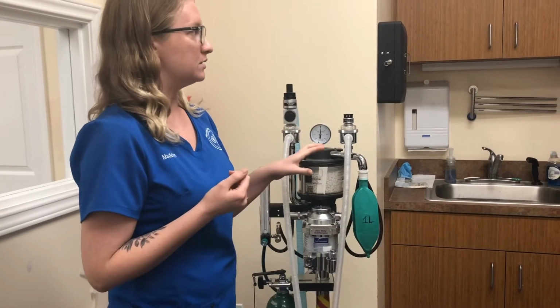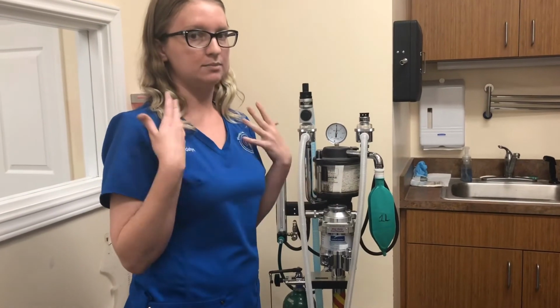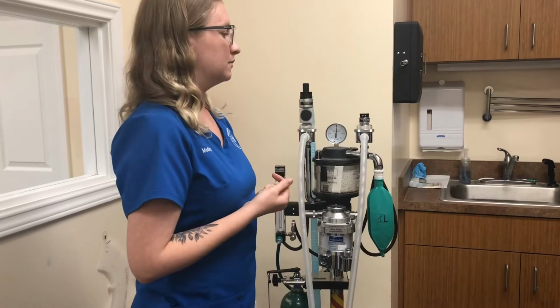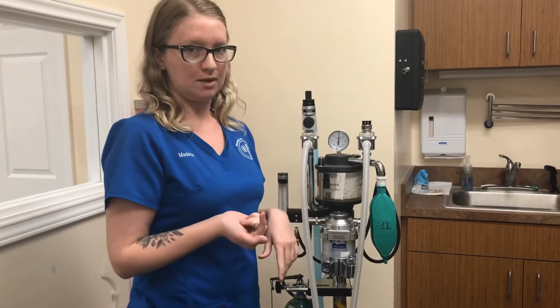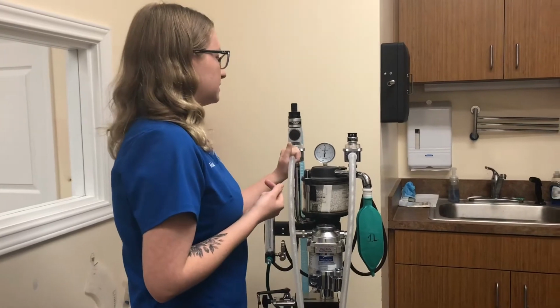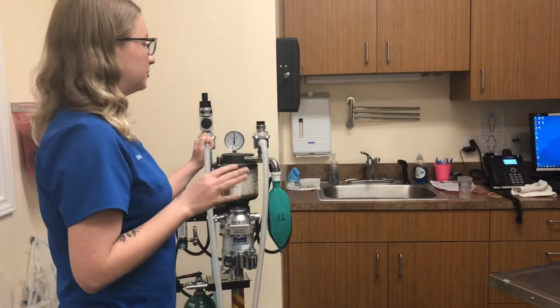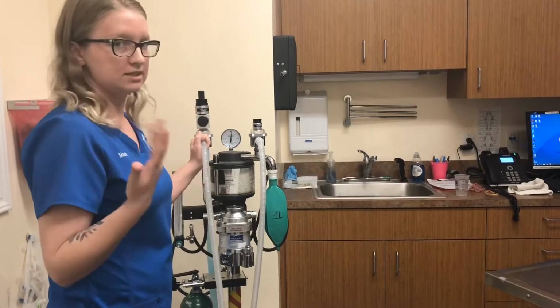We don't have one of those at the clinic right now, but that would be advantageous for small patients because it would be less resistance. But on the other hand, it's a higher risk of hypothermia because you don't have the reheating element to it. Rebreathing systems also use less oxygen and gas, but non-rebreathing systems use more of that because they don't recycle.